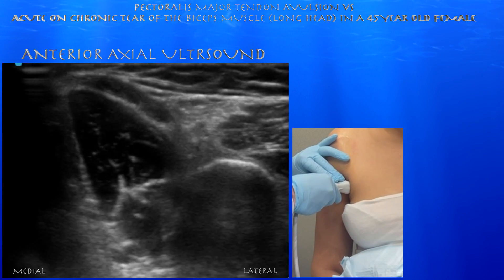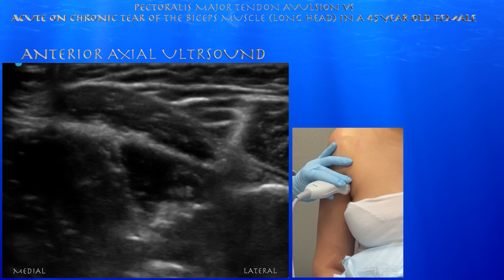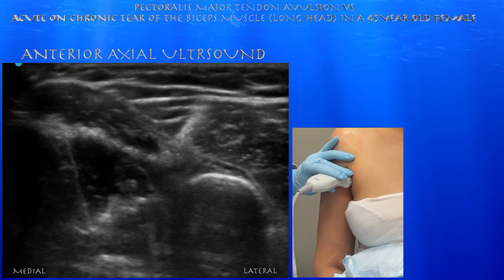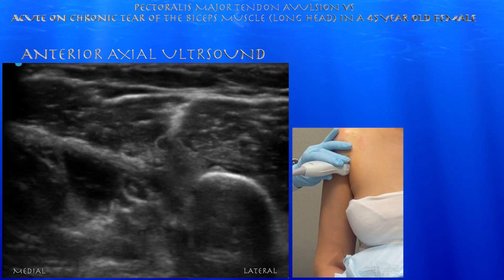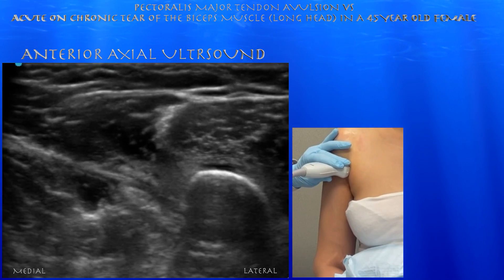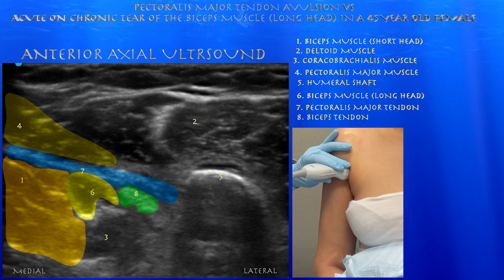Now we're switching to an axial plane. Here you can see the division between the long and short heads of the biceps muscle. You can appreciate the biceps tendon here, tucked under the pect major tendon, just near the humeral shaft.